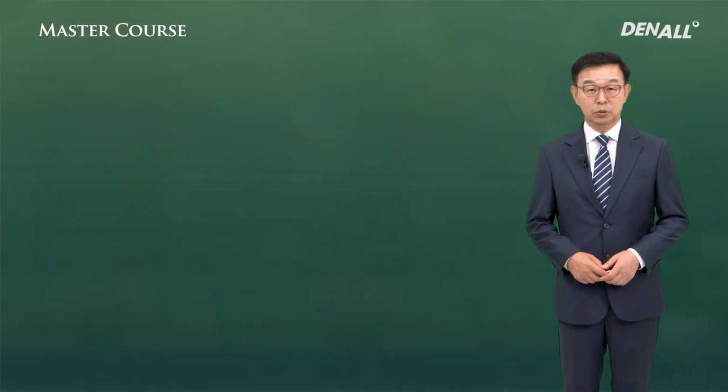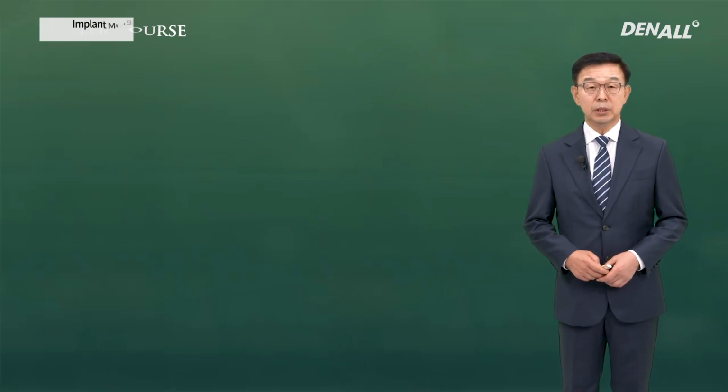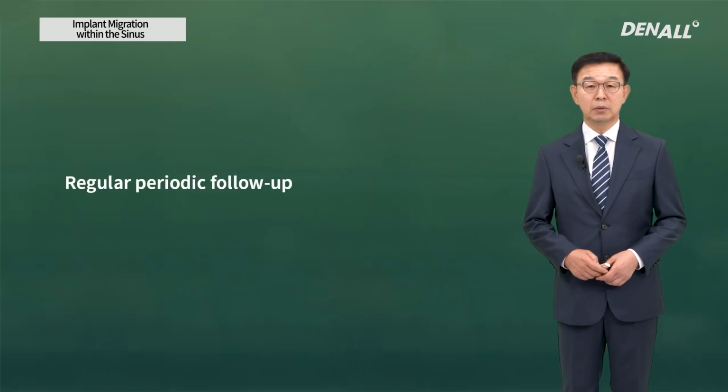At times during surgery or afterwards, the implant can fall into the sinus. This happens quite frequently. Therefore, the most important thing is to do accurate surgery and to do regular periodic checkups.